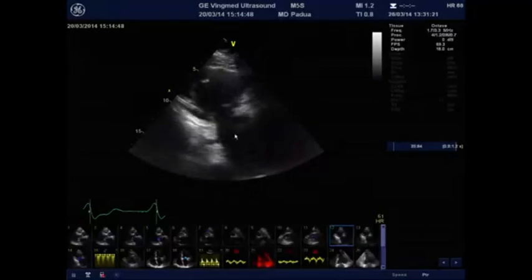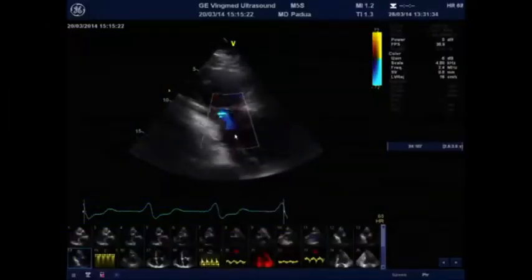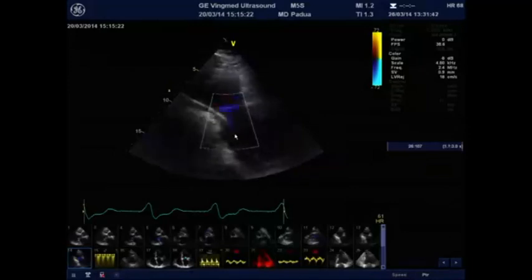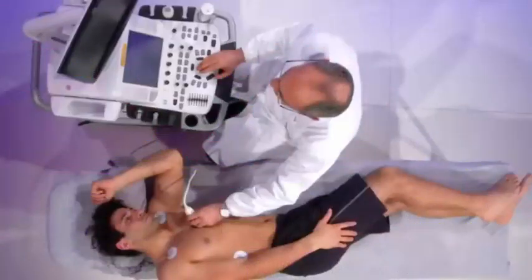This is the right atrium, and what I have to look at here is the position of the wire within the tricuspid valve, and also the presence and the severity of tricuspid regurgitation. Tricuspid regurgitation is quite common in patients, particularly those with old heart transplants, since it is a common complication of the frequent endomyocardial biopsies that these patients underwent during their follow-up visits.